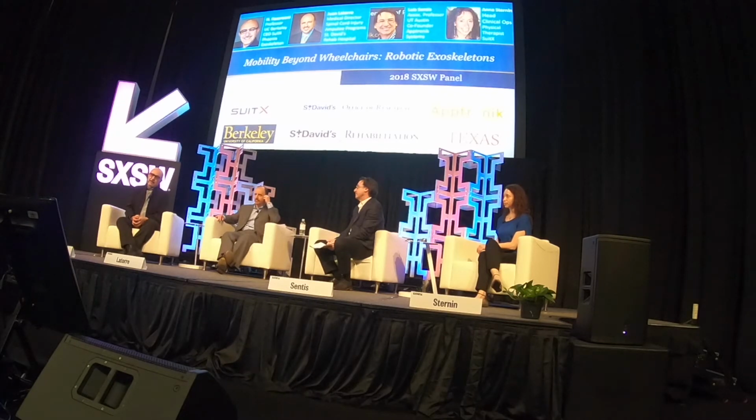And of course, we're all struggling to push that technology. This is just not about the hardware. It's a lot of software, infrastructure, communication. As you just noticed, this machine has two computers. One is running the machine. The other one is communicating with a little iPad that records every piece of information that he has. So that information would be accessible by a physician through a cloud. So we're getting to that point of creating a situation where you bring all that technology to home rather than bring a patient back to the rehab center. I mean, I don't know how long it's going to take. I hope sometime I'll be able to see it, but that's the vision we're having.